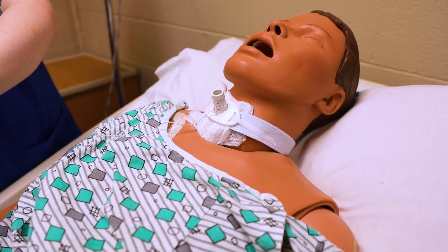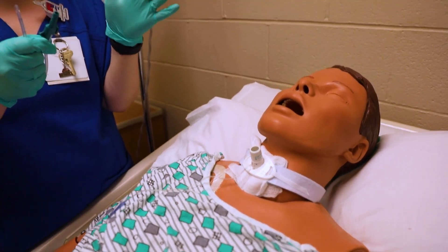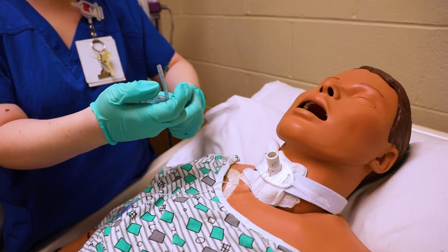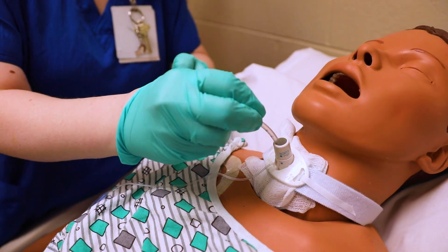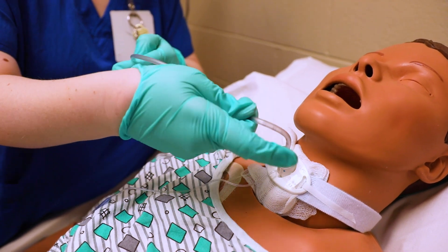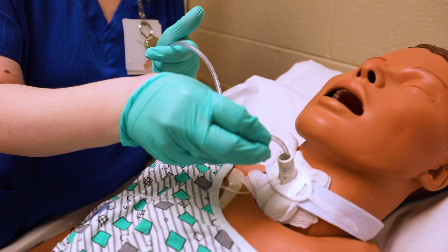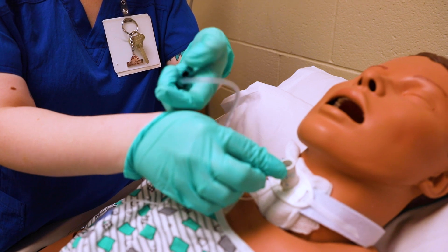Since I have removed the hyperoxygenation, this left hand is no longer sterile. I'm going to hold my tubing — remember, it's hooked up to suction — and I can go ahead and start feeding this into the patient's trach. This can start causing the patient to cough. Once we get in, you're going to see this little green thing right here.